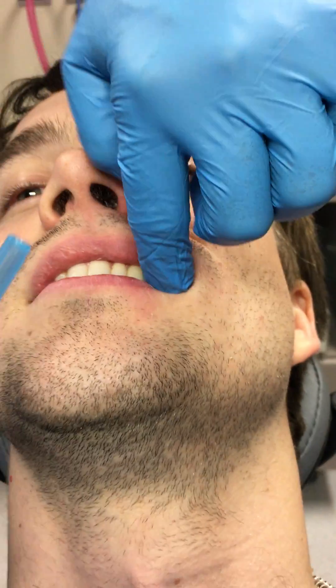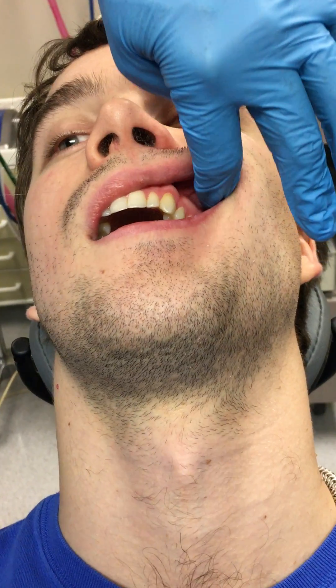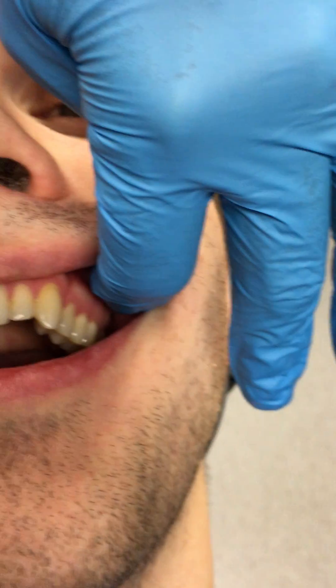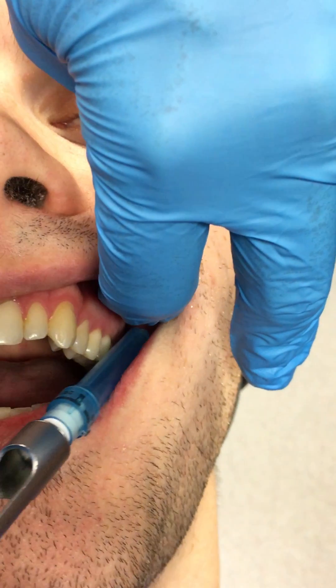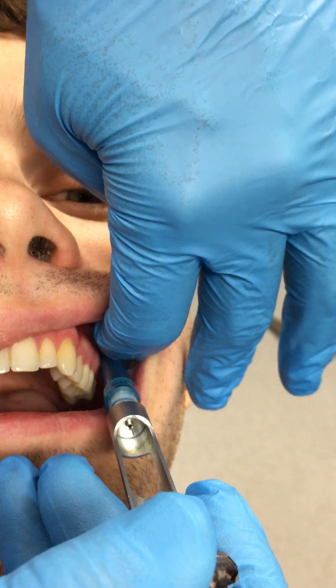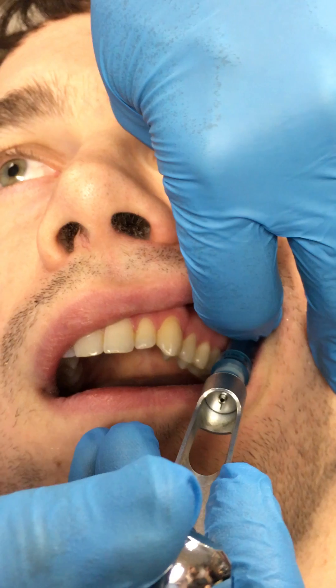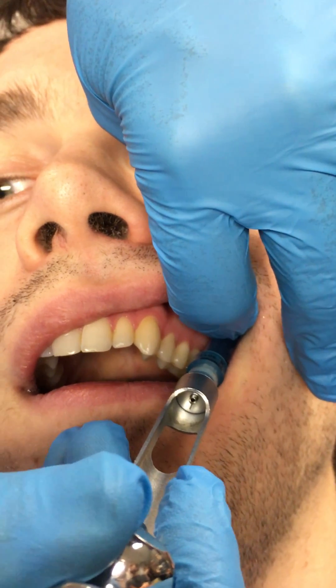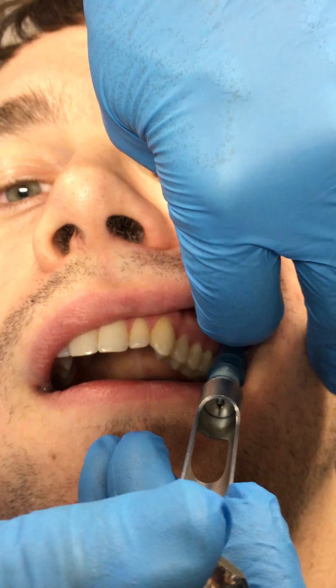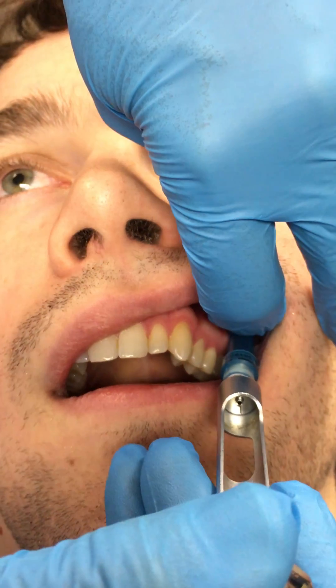So let's have a look at the PSA block. I palpate his zygomatic buttress — everybody knows what the zygomatic buttress is. Your injection goes up, posterior, and medial. You slide the needle up about one and a half centimeters and you inject. It is an absolutely simple injection.